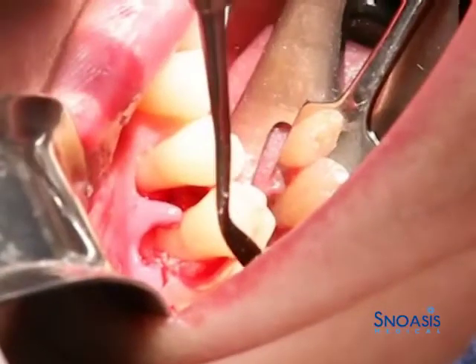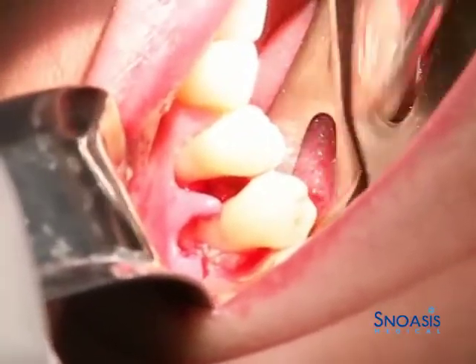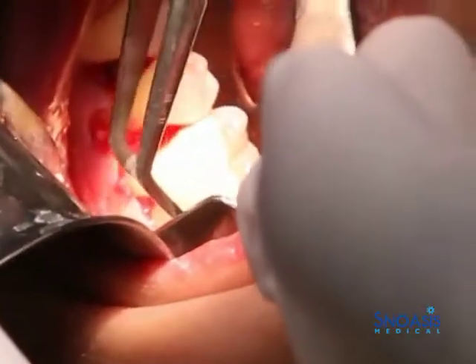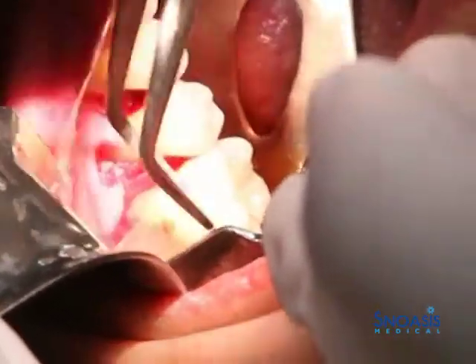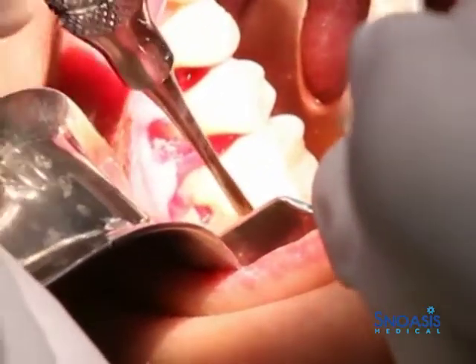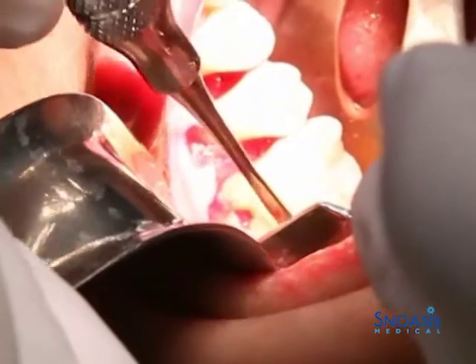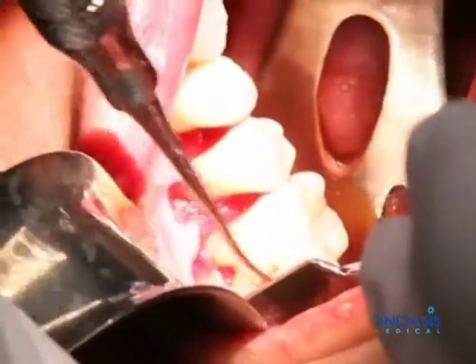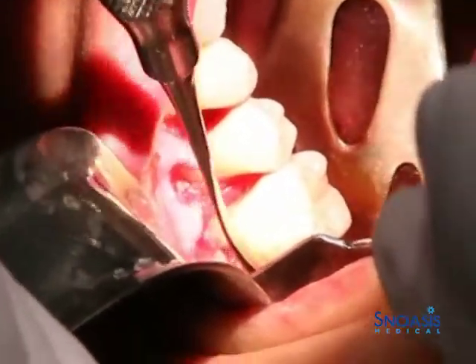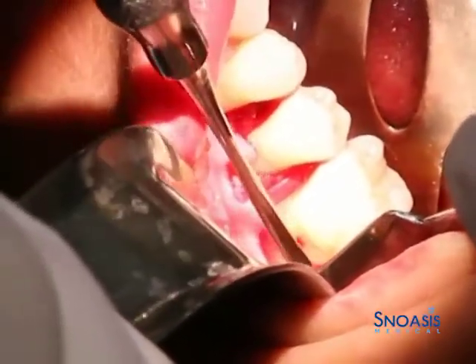Okay, so you can see on the inside it's folded upon itself, which is fine. Actually, I don't mind if that happens because now I've got a double layer. And so we just get it in there a little bit like that. Just advance that through. And as that hydrates, it just makes it a little easier to manipulate.